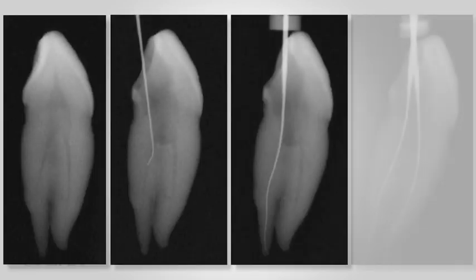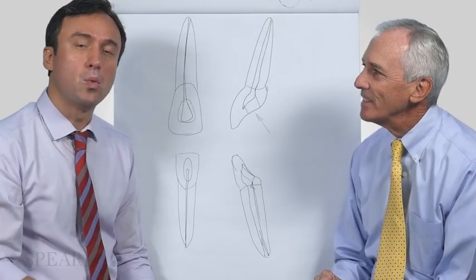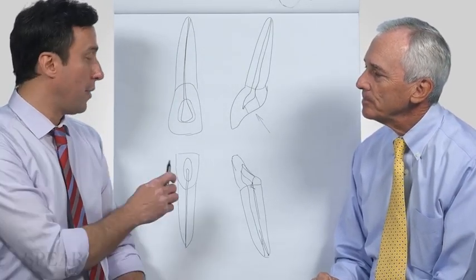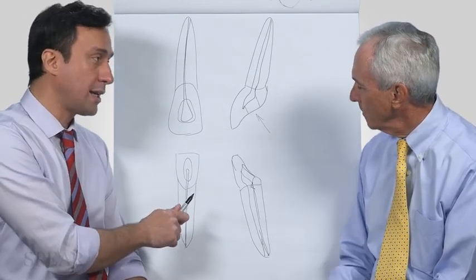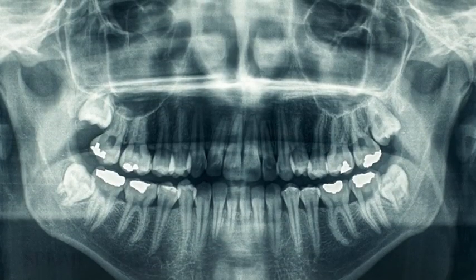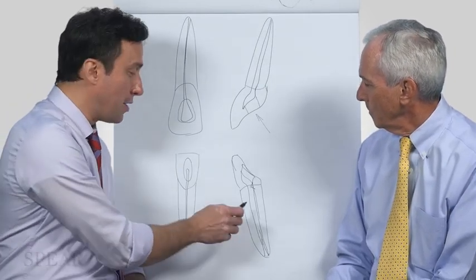And that could be found and treated by pre-curving your file and placing it into the canal on the lingual side. How do you do that? It just has to do with proper visualization first, obviously, which is an important thing, right. By having good loupes and magnification, identification that there is a second canal, and you should really assume that. Now, it's very difficult to take an angled x-ray from a lower central, but it's possible. So try to do that too. Oftentimes, you will see a very broad root. That there is a second canal.